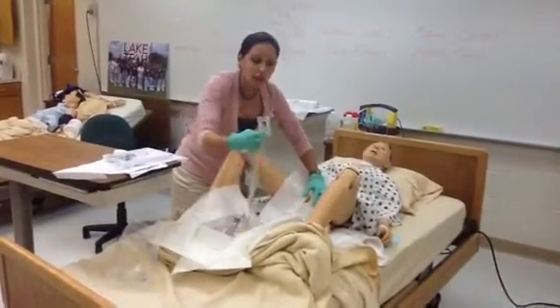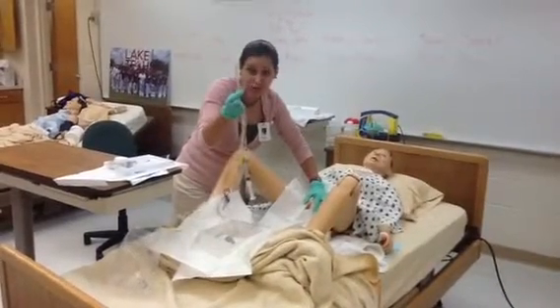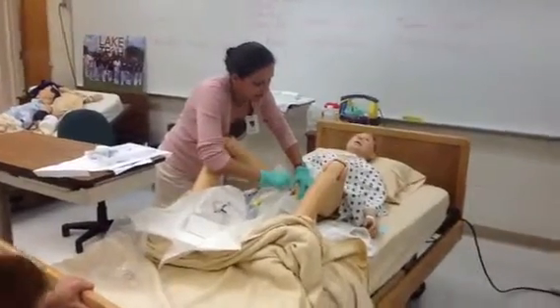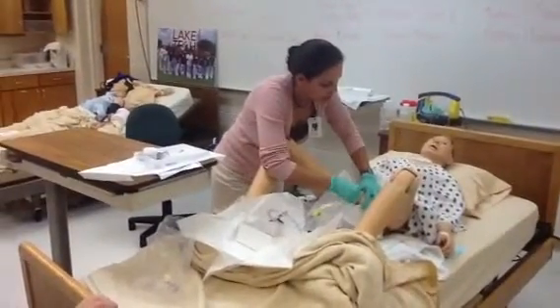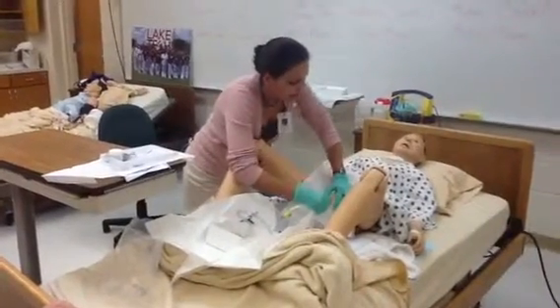And the next thing that you're going to do is take this catheter, nicely filled with lube. You see my hands are still not touching the catheter. And I'm going to go ahead and introduce it straight into the urethra. Okay? And I'm just going to twist it and turn it and put it in here.